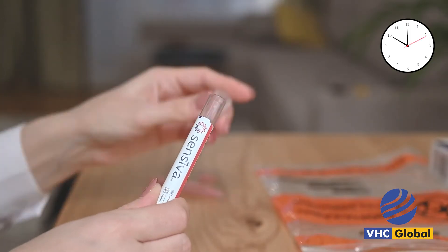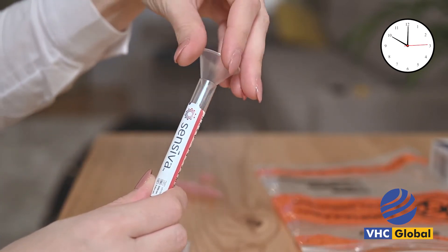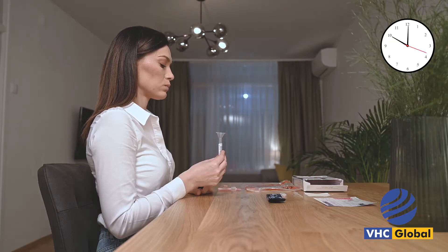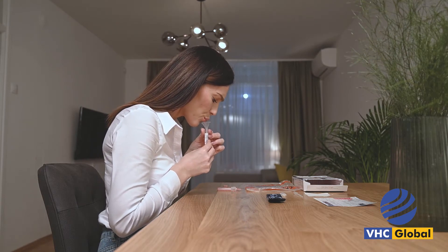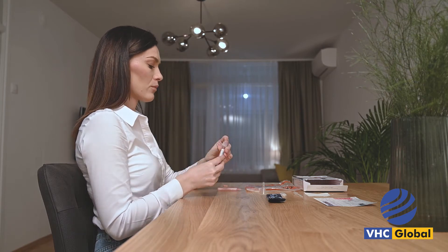Remove the cap from your empty labelled test tube. Insert the plastic tube into the funnel. Do not touch the inside of the funnel. Slowly and carefully spit all of the saline solution into the labelled test tube using the funnel. After closing the tube, shake for 2 to 3 seconds.